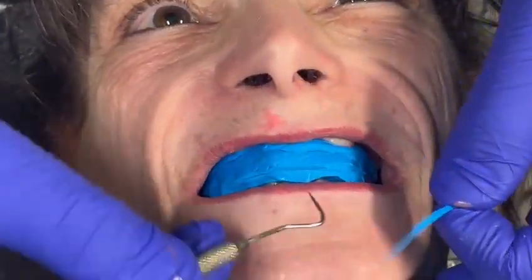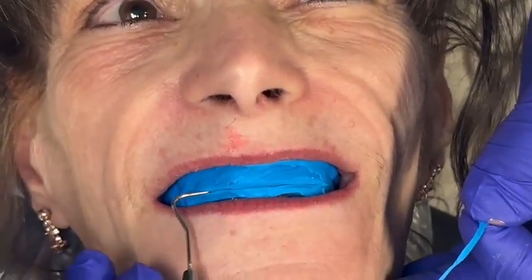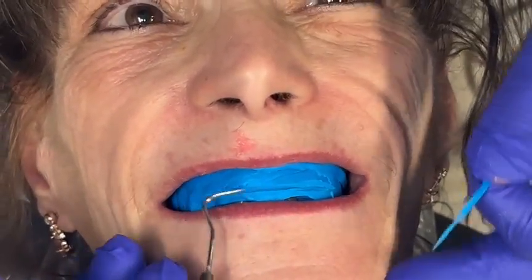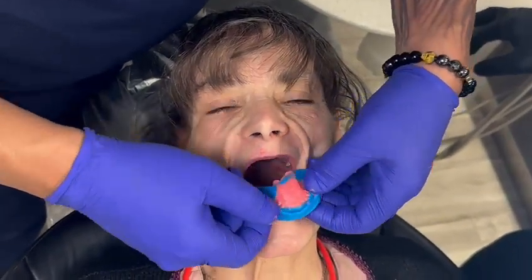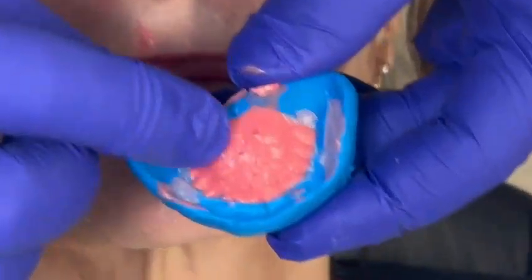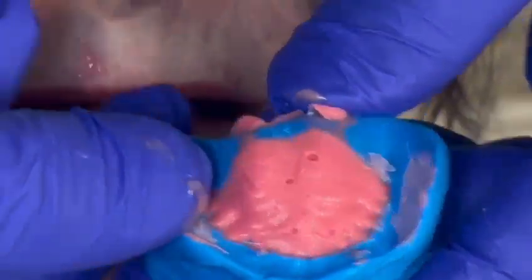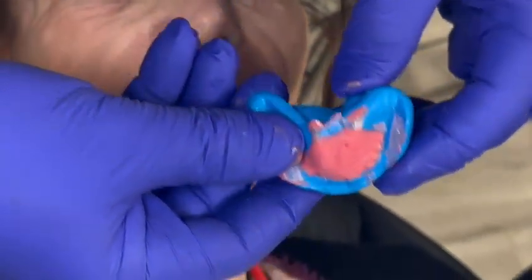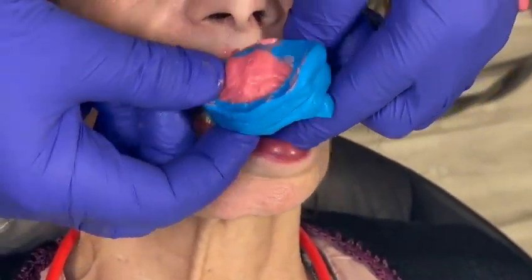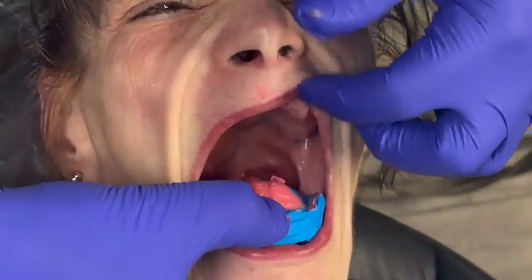Now we've got, when she smiles, my designer has something that they can follow for an incisal edge. So let's pull this out and see — open a bit. Now I've got some good detail on there. I can see my nice rugae. Let me see a bite down a couple times.